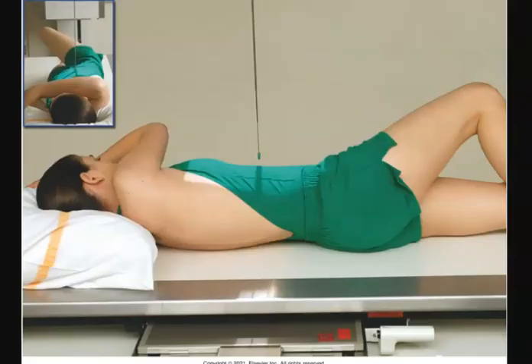Here's another view of the X-ray room, but in this case we're looking at the X-ray table. She's laying on the table. She's being positioned for an X-ray. You can't see the X-ray tube this time, but they're indicating that their central ray is coming down right here. And this is our field of view here, or FOV. You'll hear that terminology too sometimes. That's this light right here. That light shows you exactly where your radiation is going to go and where you'll end up having your X-ray. So your X-ray will include all the anatomy that's right here.